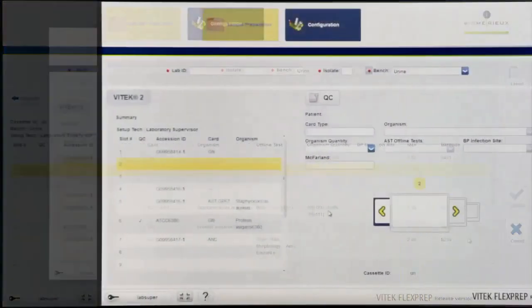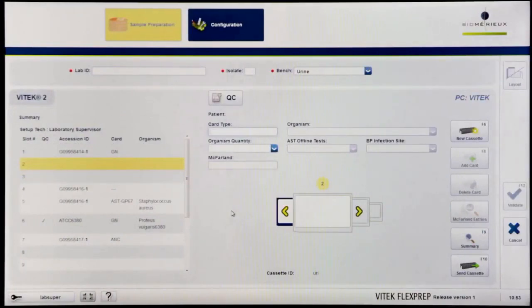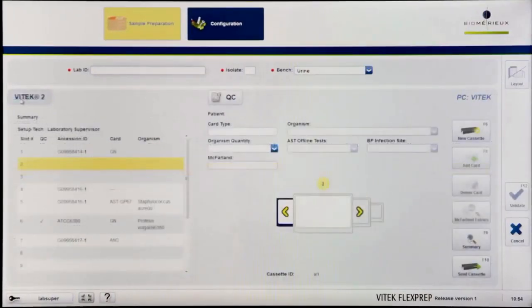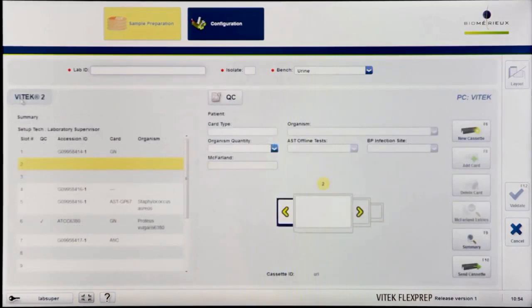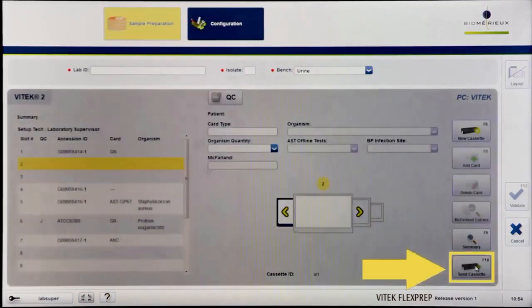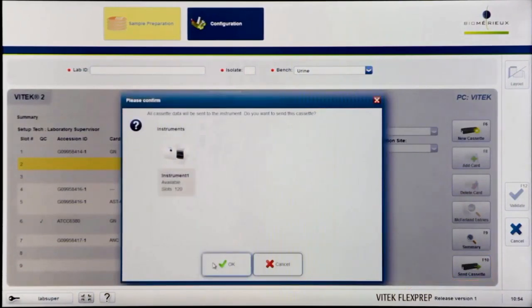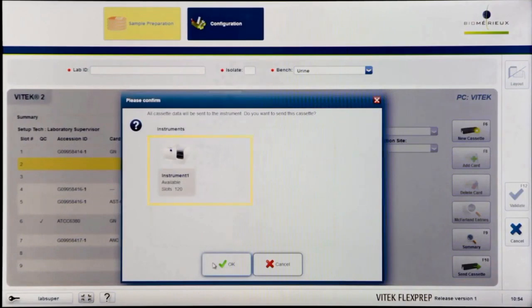Click back or press F9 to return to the cassette definition screen. Upon completion of a cassette, click the Send Cassette icon or press F10 to send the cassette to the Vitec 2 PC. A confirmation dialog box will appear. Select OK to send the cassette. The definition will be sent to all of the listed instruments.